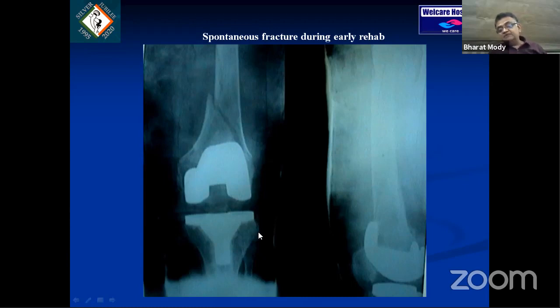I think what had happened was that this lateral side tension, which I'm trying to show with the cursor, this tight tension here, had actually caused this. Someone would say that it was notching, but the fracture plane is where I wanted to bring home the point, because exactly the same thing happened. I had no option. In those days, it was a minimally displaced fracture, and I chose to treat it just with a plaster cast.